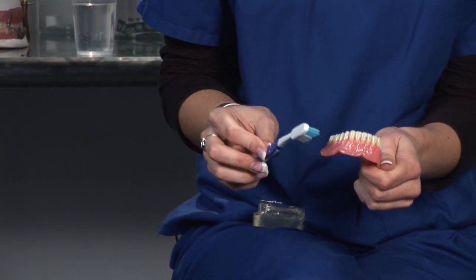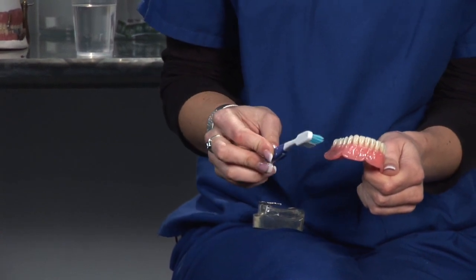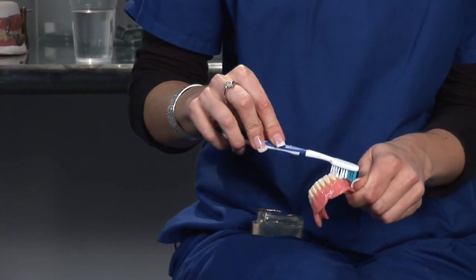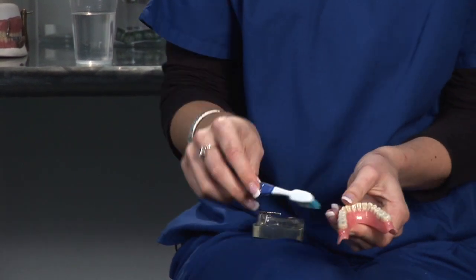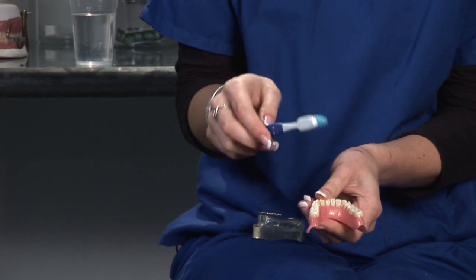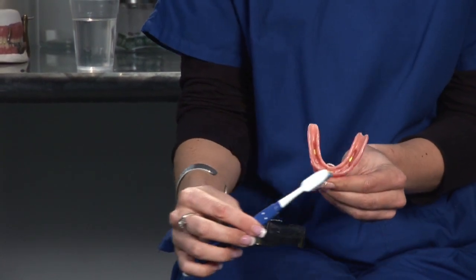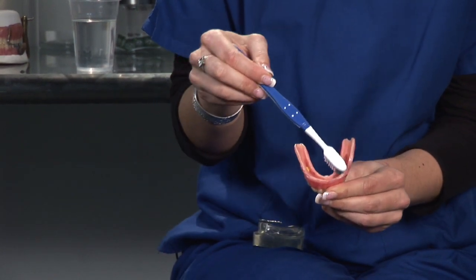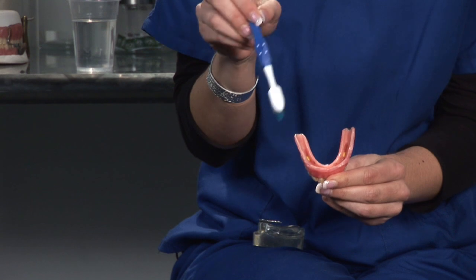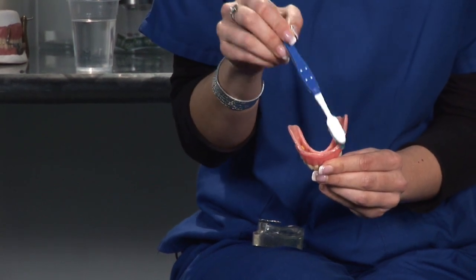Brush them on a regular basis, at least two to three times a day, in a circular motion on the top and front side. Do the same thing on the inside as well. A lot of patients forget they also have to brush the inside of the denture. This will free up any food particles stuck underneath so they don't stick to the denture.